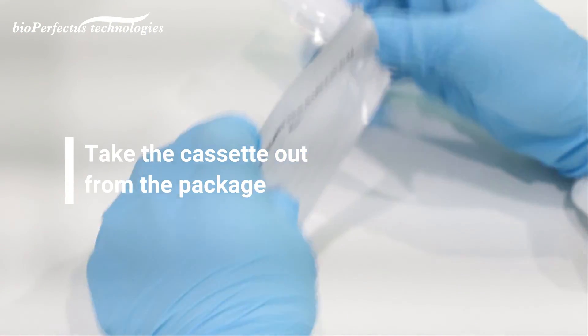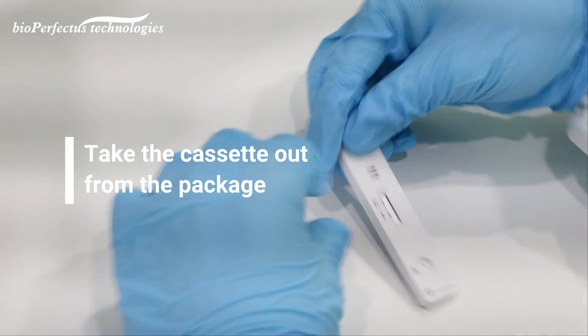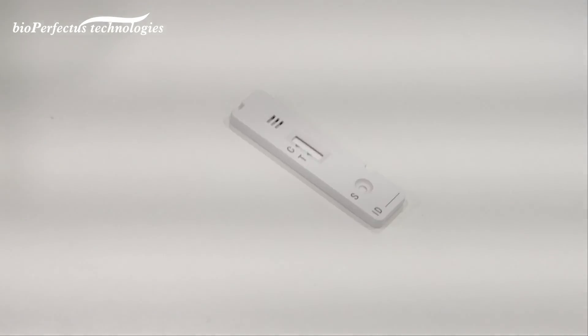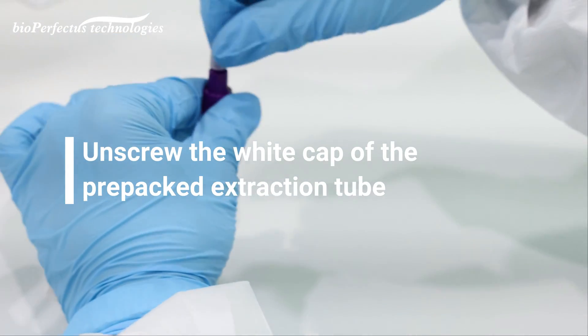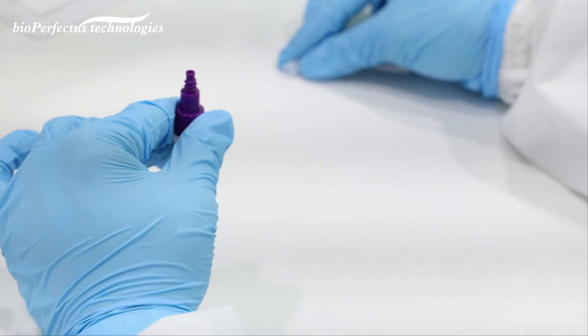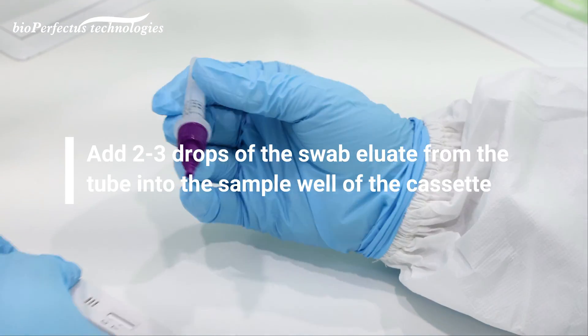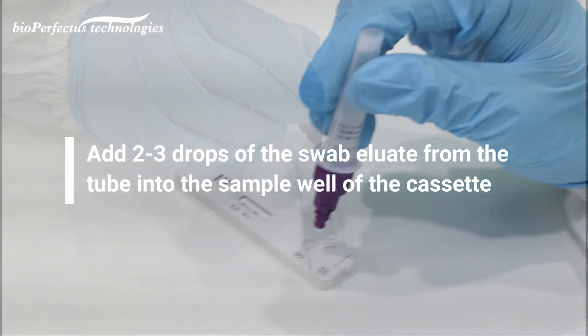Take the cassette out from the package. Unscrew the white cap of the prepacked extraction tube. Add 2 to 3 drops of the swab eluate from the tube into the sample well of the cassette.